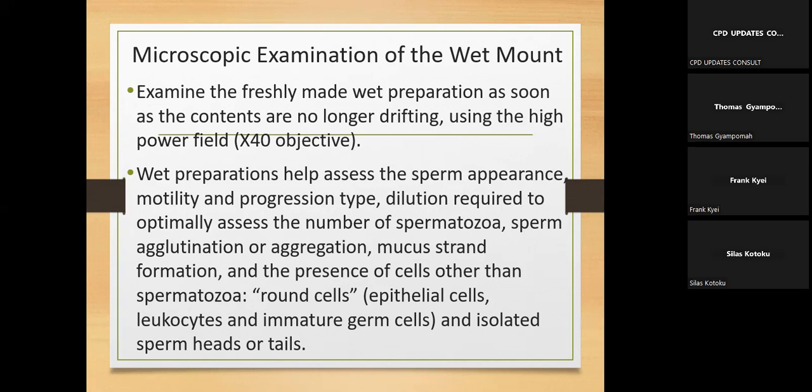If there's going to be a variation, it's going to be a result of variation consequential to the semen production, because we said that semen production is highly variable, subject to substantial variation. Otherwise, if somebody is repeating the same specimen anywhere, and you go by these standards, you'll always be on top. All right.